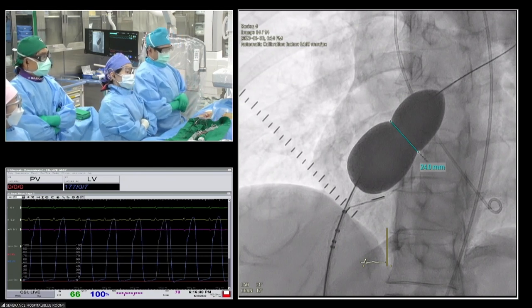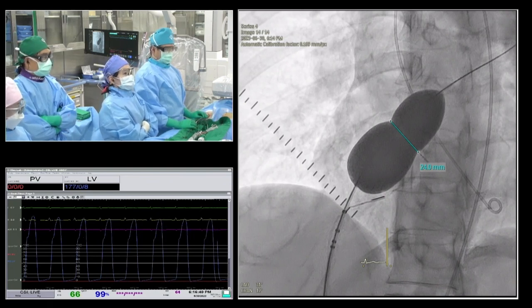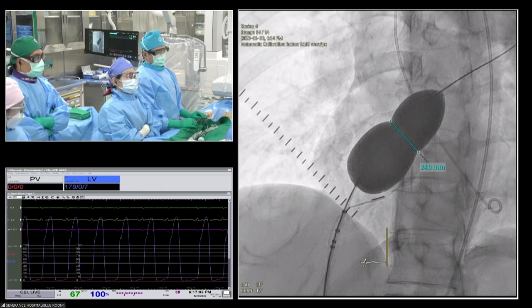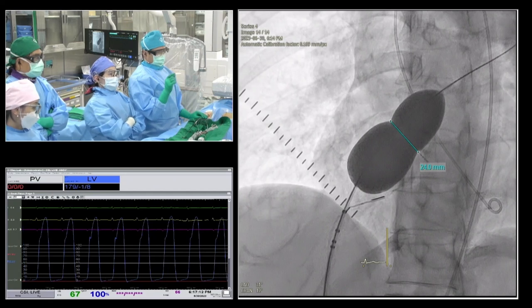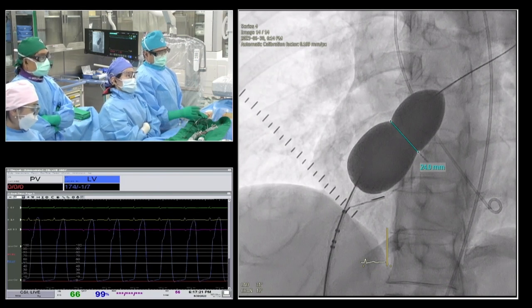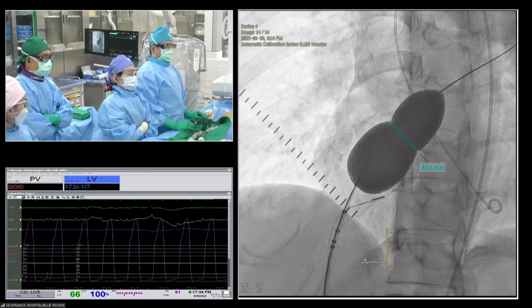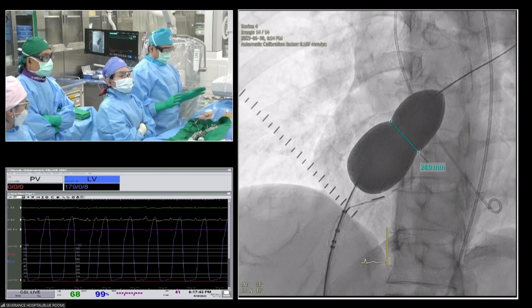Is Bharat already there? Not there. Bharat Albi showed us some case from Japan. I don't know whether this is Hide's case or Teji's case. But they put the device, and even though the hemodynamic balloon test showed the LA pressure, maybe the pulmonary wedge pressure, increased at that time, after they put the device they found the pulmonary wedge pressure acceptable, due to the flow through the wire mesh immediately after the implantation of the device. So we can expect that, but I think some fenestration which could be spontaneously closed with time may be a better option. So any other comment? Yeah, I agree.